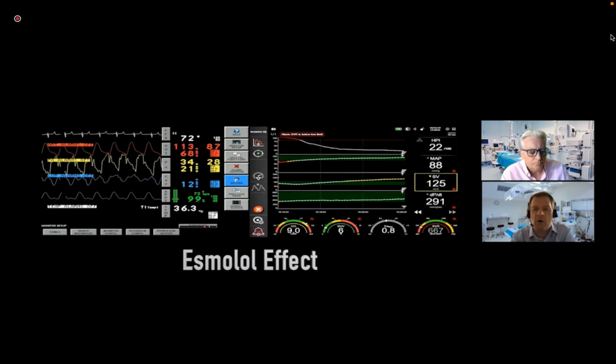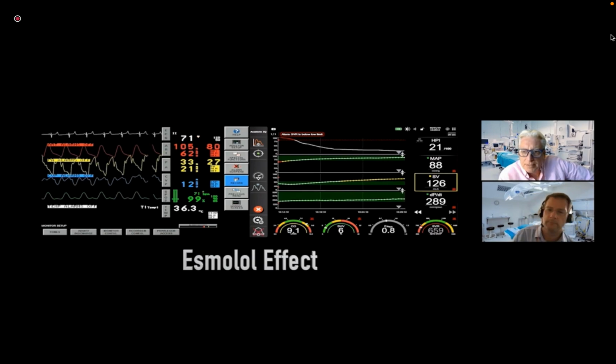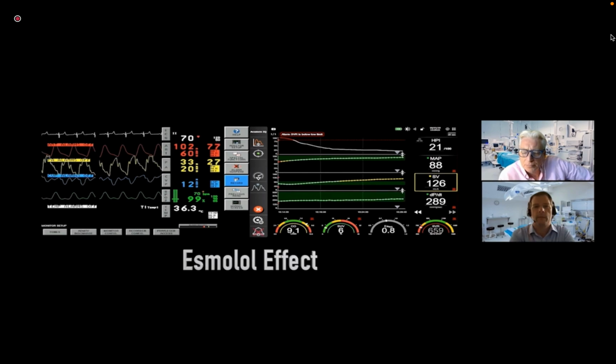Now, if we run the model here, what we'll see is the model's being delivered a bolus of esmolol, and we should see some of the negative inotropic effects. And Monty, just remind me, esmolol's quite a short-acting drug. Yeah, it's fast on, fast offset, so it has pretty immediate effects and highly selective beta-1 activity. So you should get the marked negative inotropic effects you're anticipating, and I presume, therefore, quite a drop in dP/dt. Absolutely.